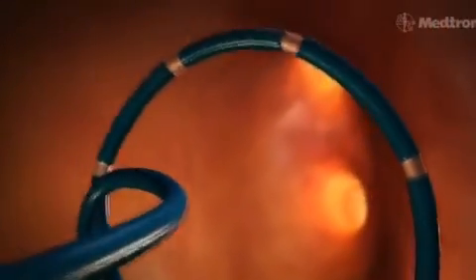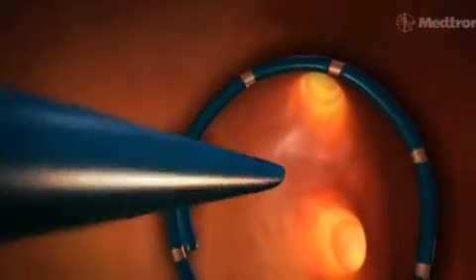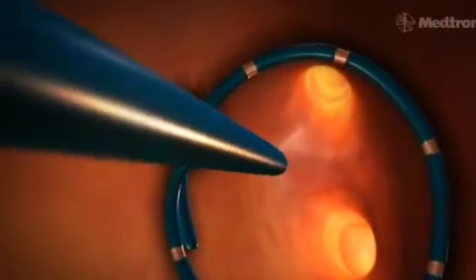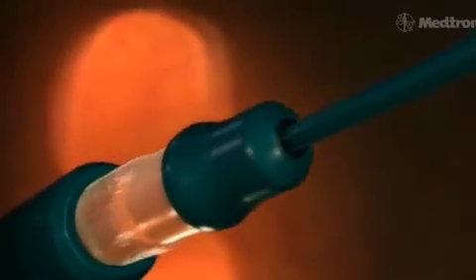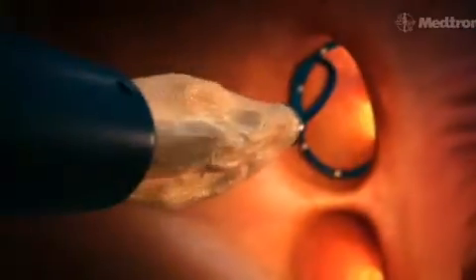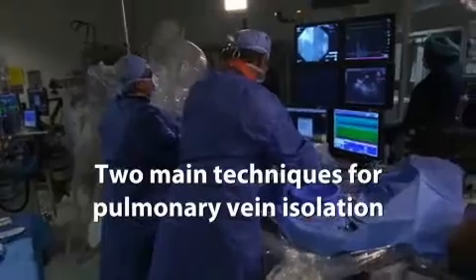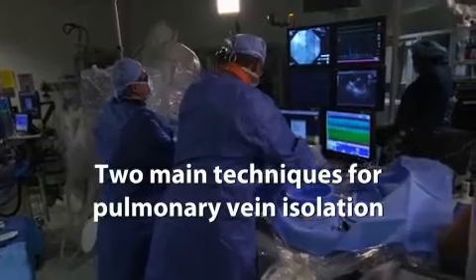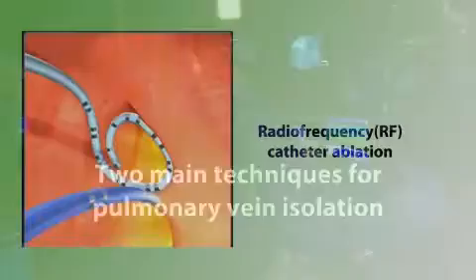During the procedure, catheters are used to terminate or ablate these abnormal electrical circuits and stop them from spreading and continuing to cause AF. There are two main techniques used to perform pulmonary vein isolation.